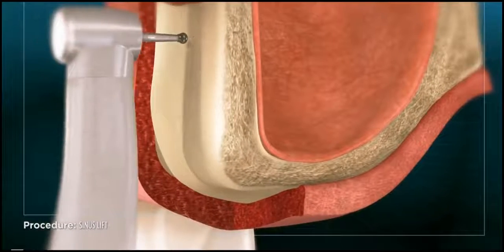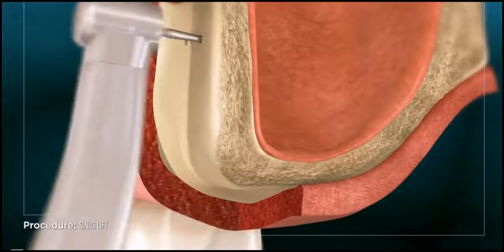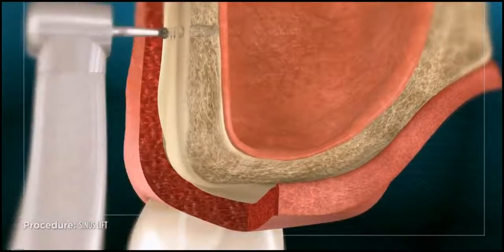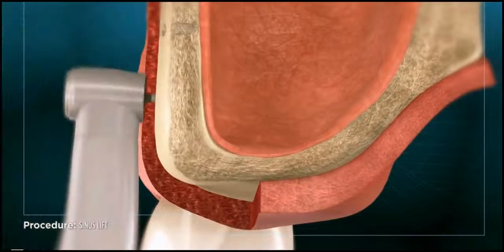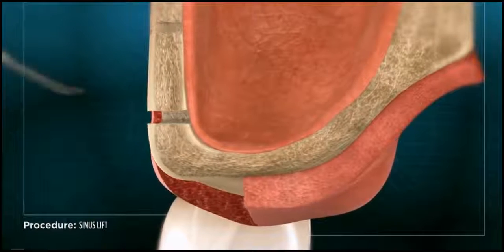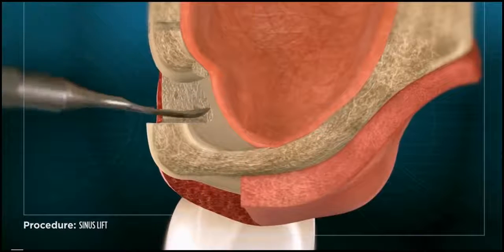A procedure called a sinus lift can be performed to add bone to the area beneath the sinus and make it stable enough to place an implant. This involves first creating an access opening in the area above the missing tooth through which synthetic or sterile harvested bone material can be placed.